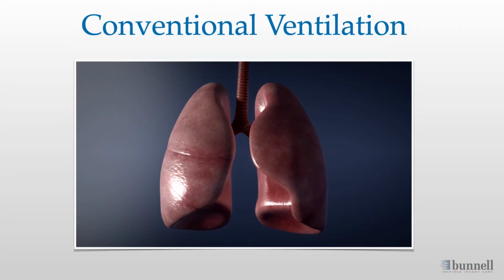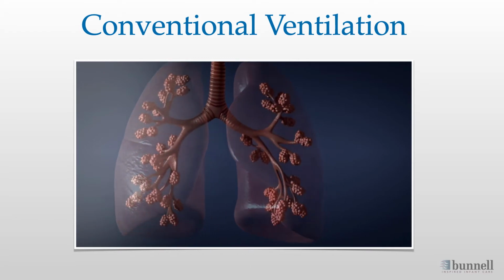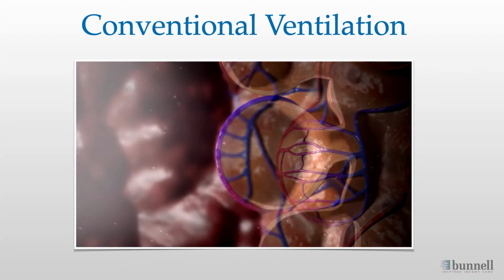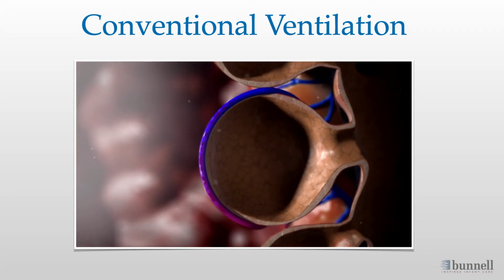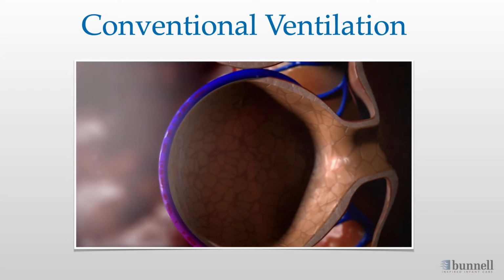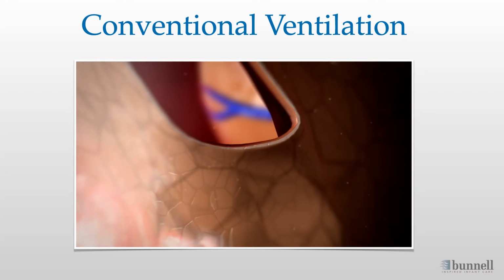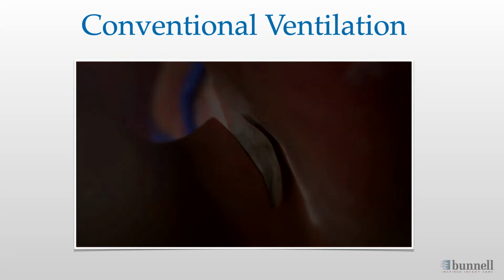Conventional ventilators deliver relatively large tidal volumes with long inspiratory times. The delivered volume reaches the distal airways and developing alveoli, which can damage the delicate structures. Distal airways, rather than the alveoli, are the most compliant part of the respiratory tract. Underdeveloped airways lack structural strength. Large conventional breaths cause them to stretch and inflate more easily than surfactant-deficient alveoli. This stretch and strain on the distal airways leads to a rupture, causing an air leak.